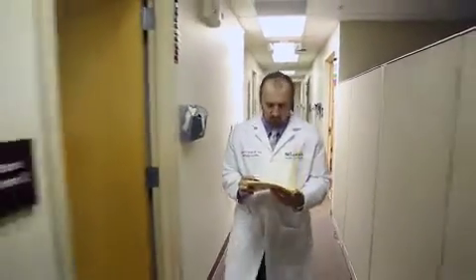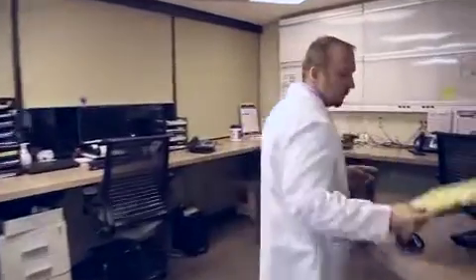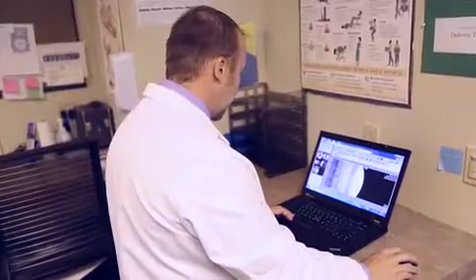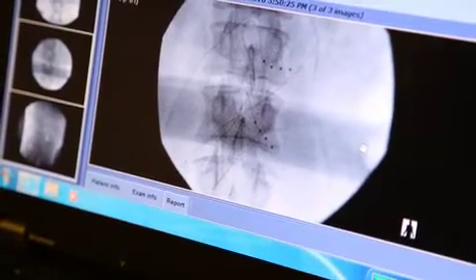I'm Dr. Steven Falowski. I'm a functional neurosurgeon in Pennsylvania. I specialize in the treatment of chronic pain. So dorsal root ganglion stimulation is a very specialized form of what we call neuromodulation. Essentially, it is a treatment that's used for focal pain conditions.